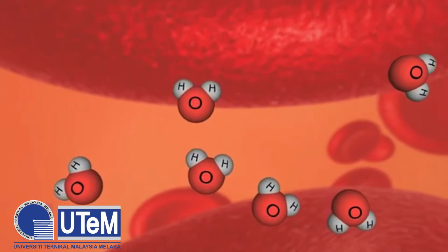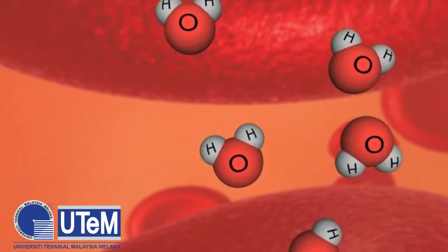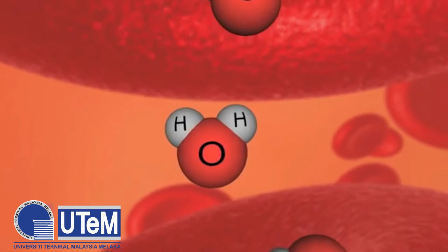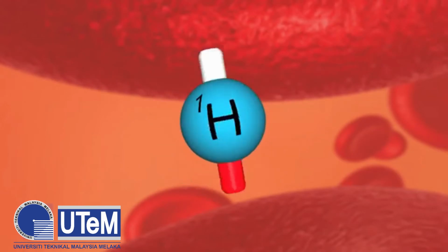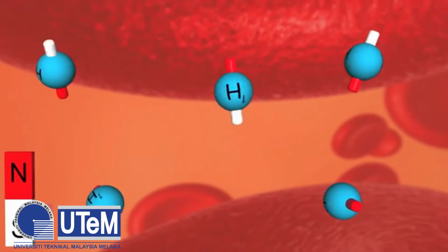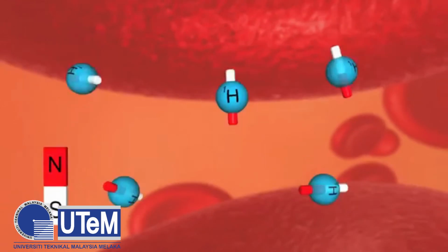The human body is made up mostly of water molecules, or H2O, so it contains lots of hydrogen atoms. These atoms react in a very useful way to an MRI's main magnetic field and the radio waves it emits. In the nucleus of every hydrogen atom is a positively charged proton that spins around an axis, like the planet Earth, spinning with a north and a south pole.